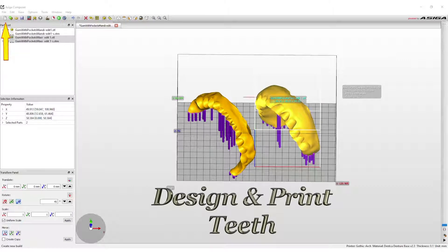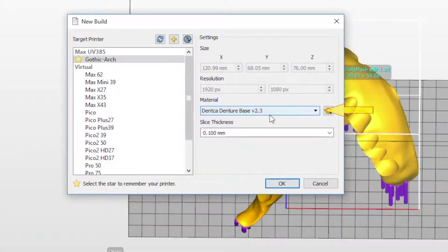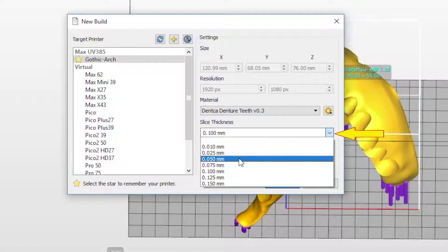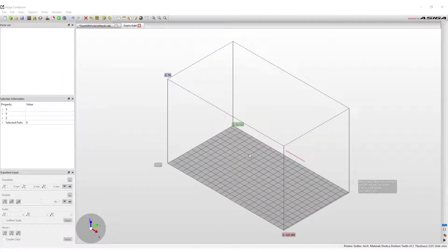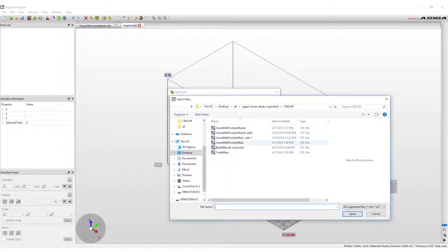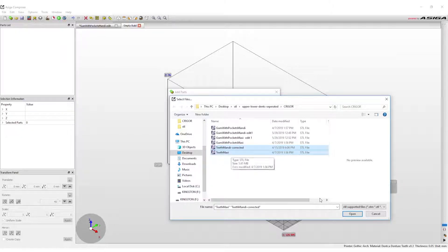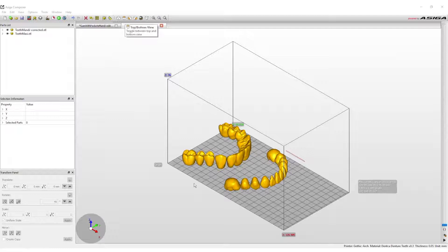To print teeth, start a new build by selecting the New Build option in the top options line. This will open the new build window. To change the material for the tooth print, click on the drop-down menu and select the denture tooth material. The slice thickness must be at least 50 microns, which can be changed in the slice thickness drop-down menu. Then press OK. The new build project will now open. Click Add Parts from the menu bar in the upper left-hand corner, then click Select File and find and select the teeth scan. If files are separated as maxillary and mandibular teeth, they can be opened at the same time. Press Open and then Open again. The teeth scans will now be imported into the print software.